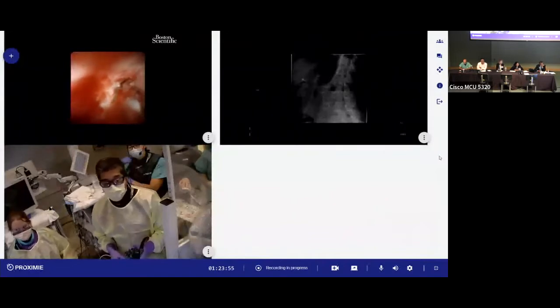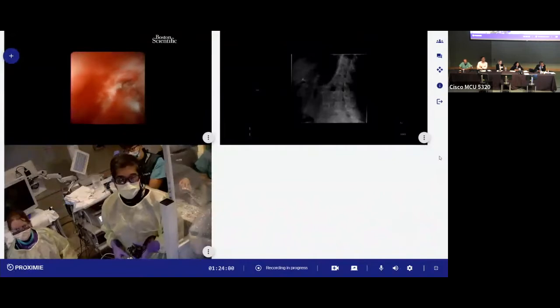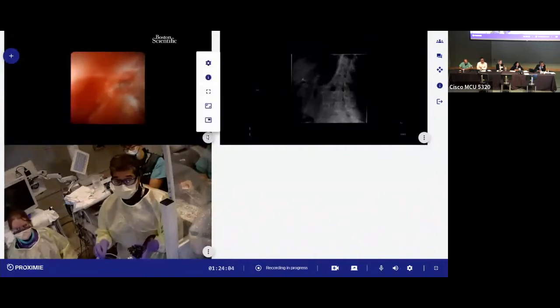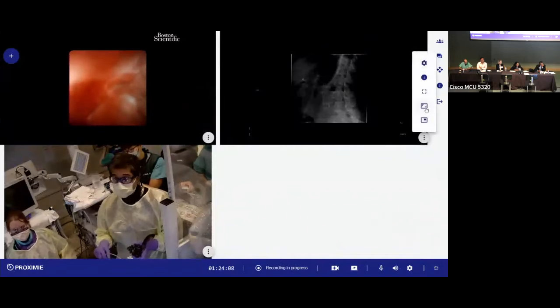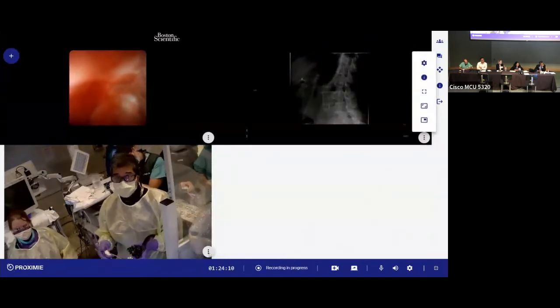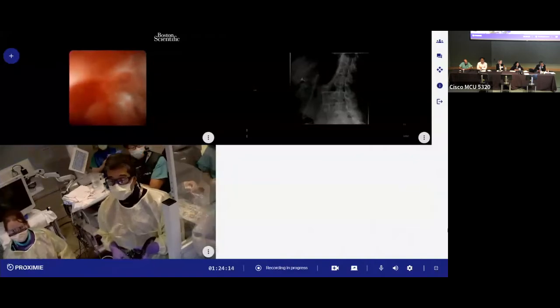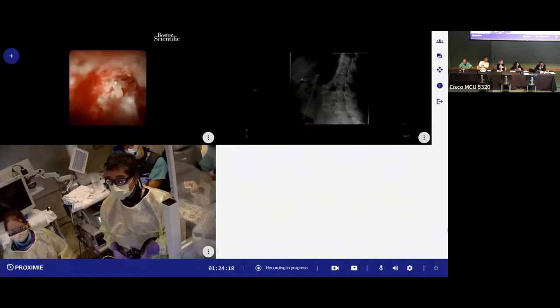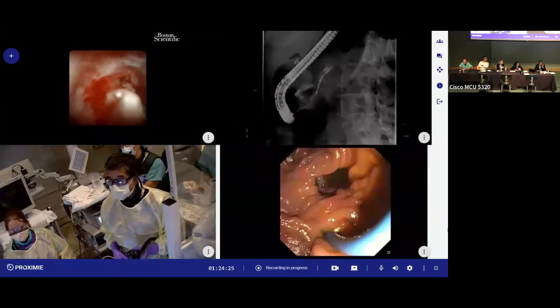So we have a stone. Dr. Anna Deloy had done an amazing job with this procedure because in her previous procedure, she had done a pancreatic sphincterotomy, placed a stent in, and upsized the stent. The patient's symptoms are actually improving. The scout film here shows the PD stent right up to the level of the stone, if you can appreciate that. Scroll the image. One more. And then here's a wire curled around the stone.